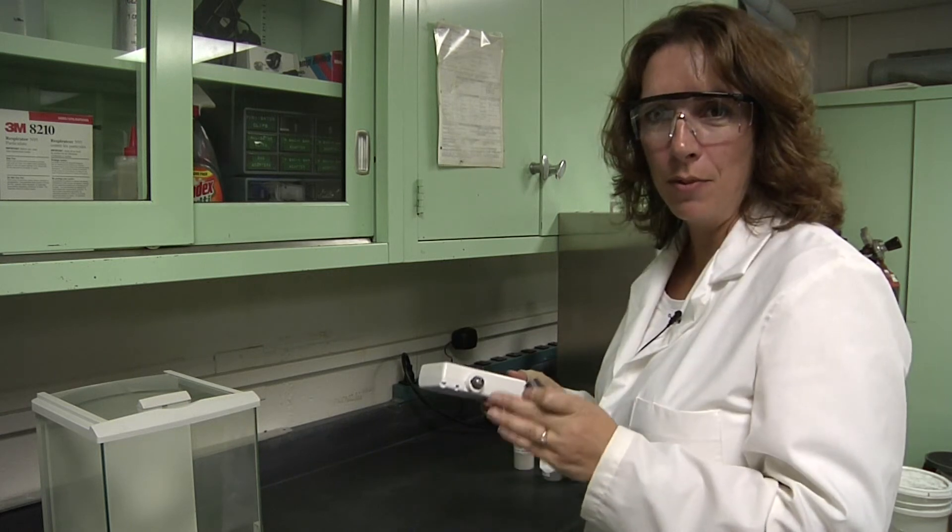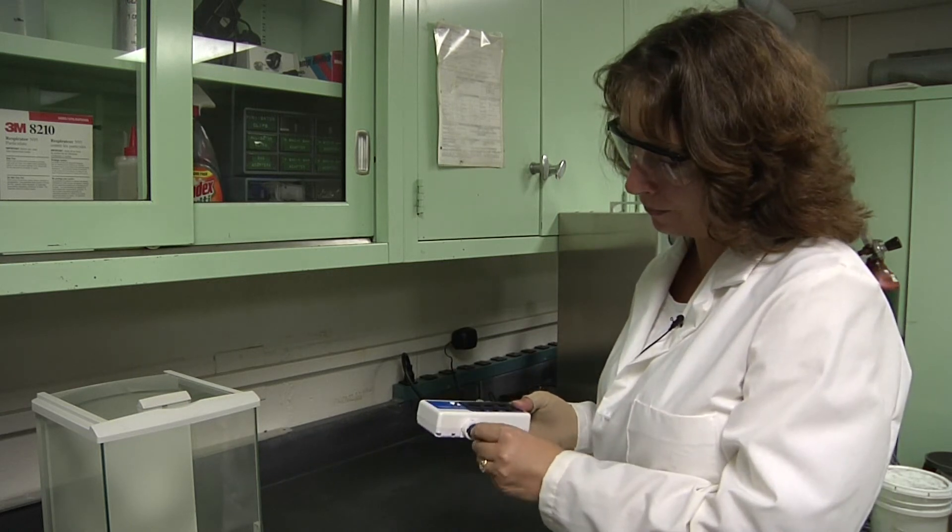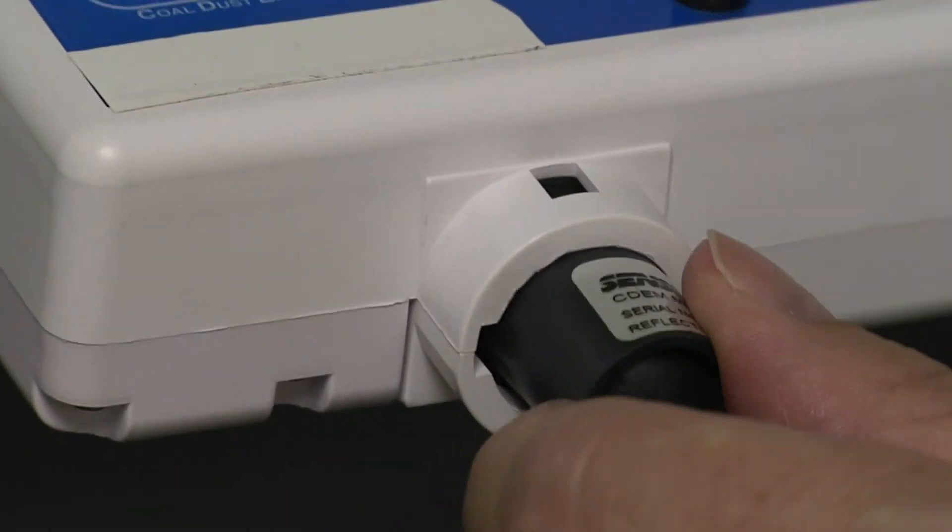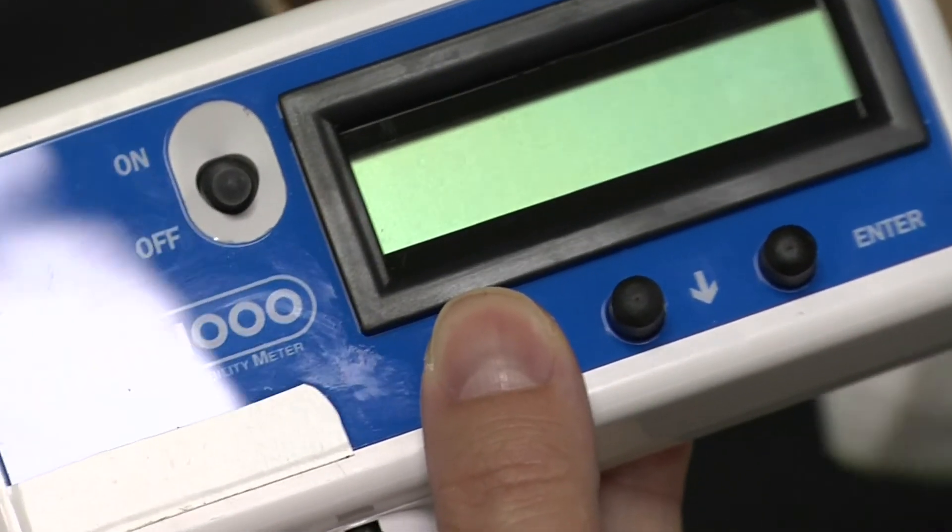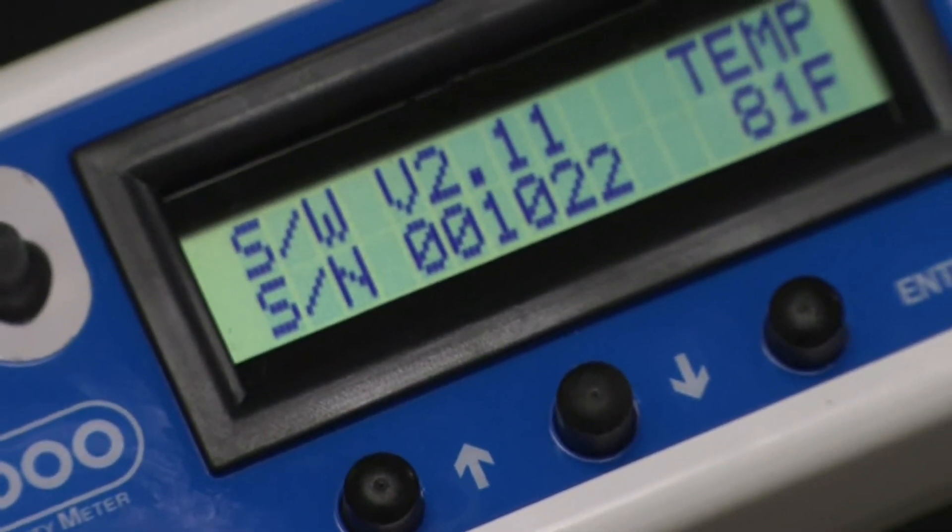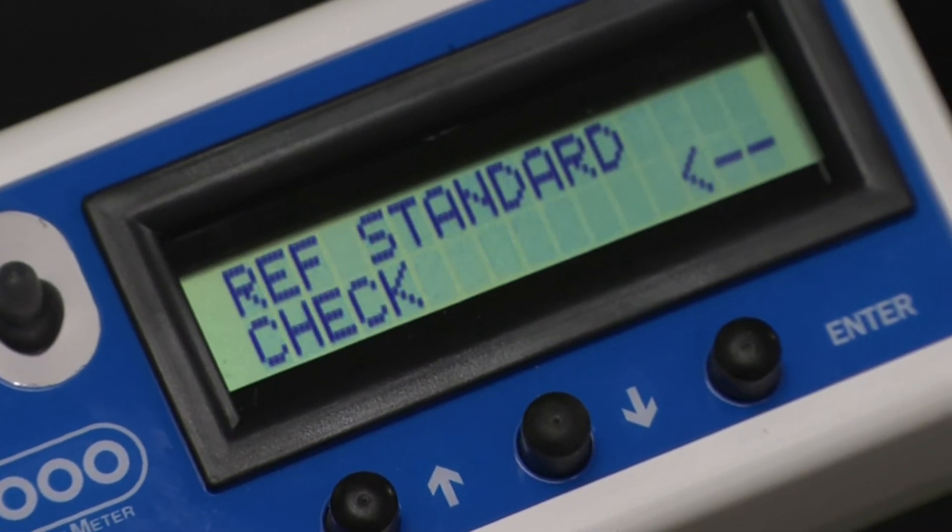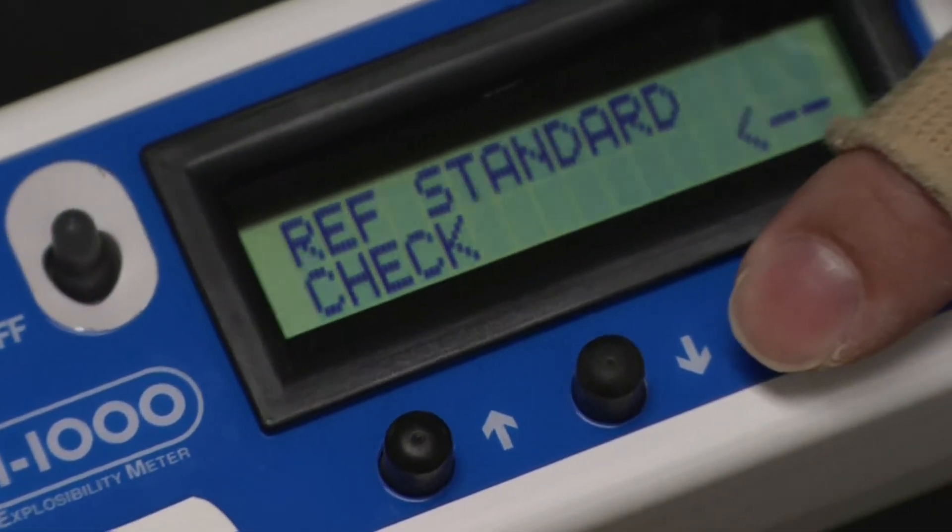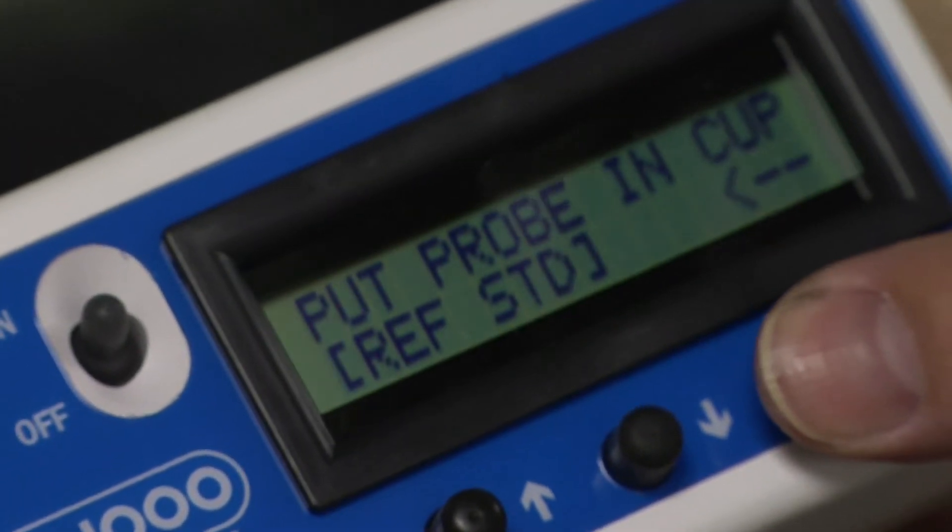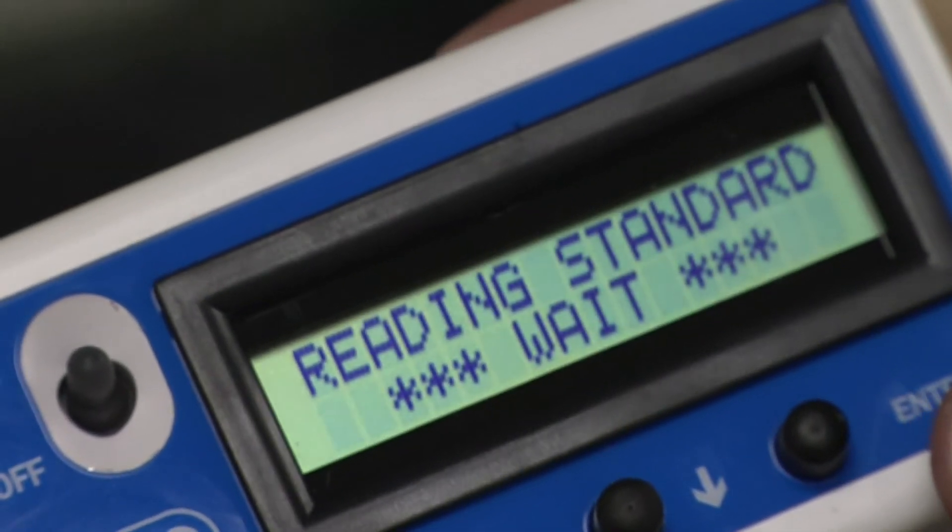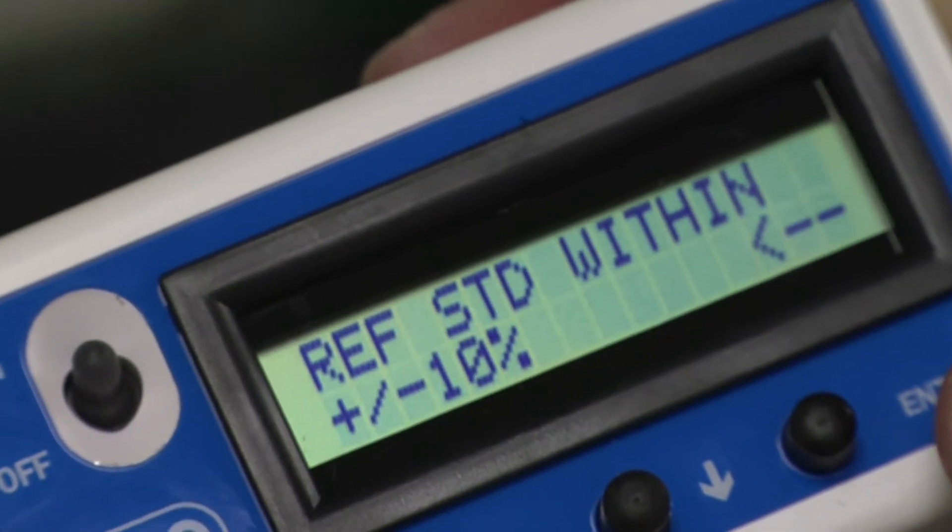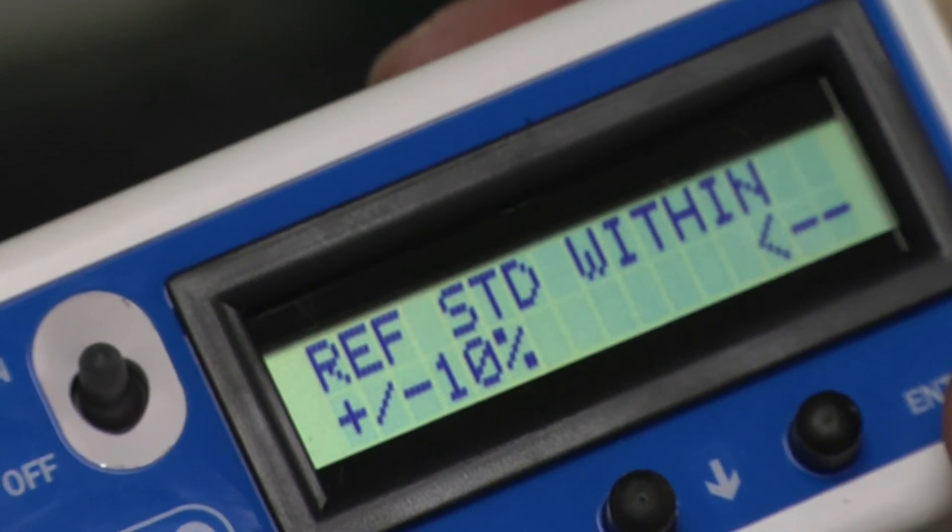To check the meter reflectance, put the cup on the meter and lock it into place. Hold in the up arrow, turn the meter on, reference standard check, enter, put probe in cup, we have done that, enter, reading standard weight, standard check complete, reference standard within plus or minus 10%.